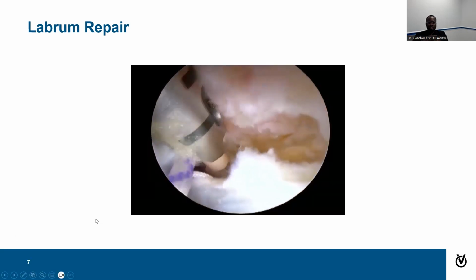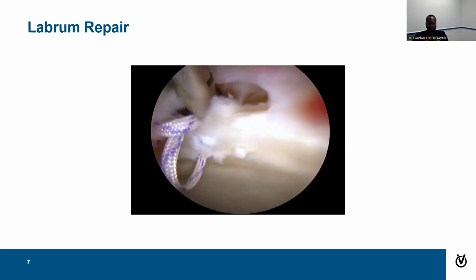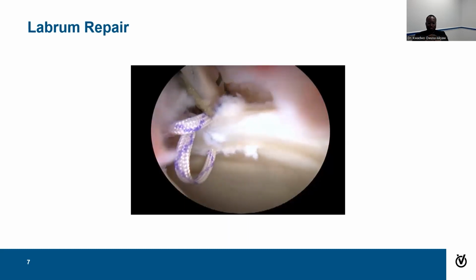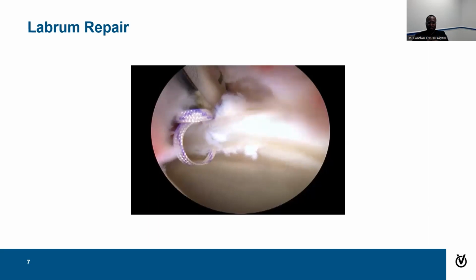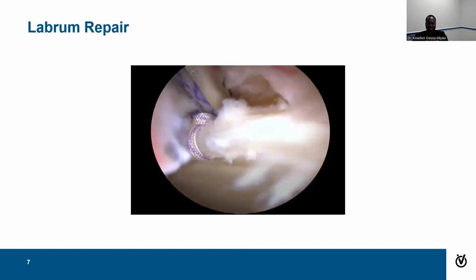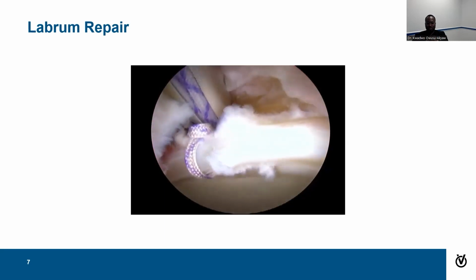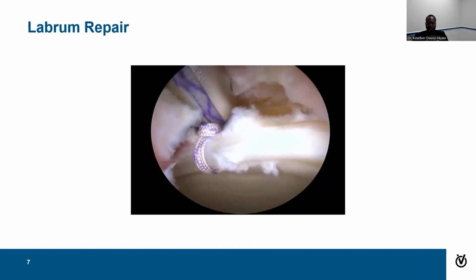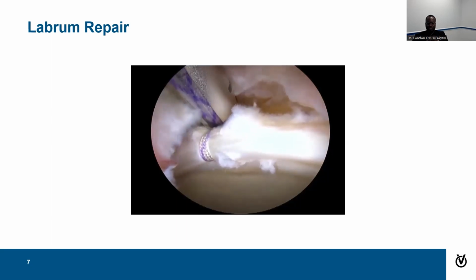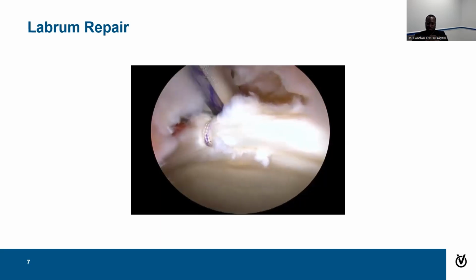Great. So then we take those stitches, or the suture that we put around the labrum, and put it into this anchor. The anchor is inserted via that little metal tube you see up to the top left. As it gets closer, you'll see that we slowly and gradually advance the anchor, and that's going to help knock that stitch into place. You see how it's slowly tightening over the labrum. What you can't see is that outside of the joint, I'm actually using a mallet or a small hammer to put that anchor down. Now you see it advancing, going into the bone, nice and solid. Once I've done that, I can tension or pull on the stitches to get them exactly how tight I want them to be for the circumstances. So that's about to happen here in just a second. Here I am pulling on the stitches, and you see that labrum sucking down right back to the bone. And that's exactly what we want to see. So that's one stitch of a labral repair. We go on to the next slide.